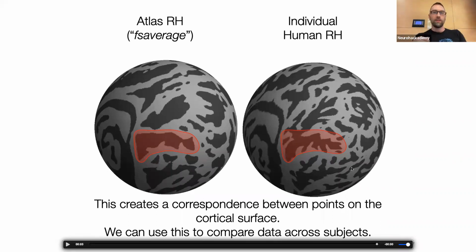Okay, so that's a very quick version of what FreeSurfer does to do, quote unquote, surface-based anatomical normalization. And this kind of normalization is much better if you study the cortical surface, if you study the gray matter. This kind of normalization is much better at lining up ROIs between subjects than any kind of volumetric registration.